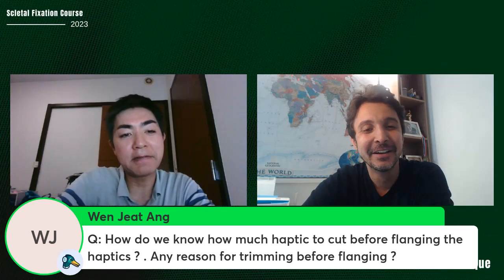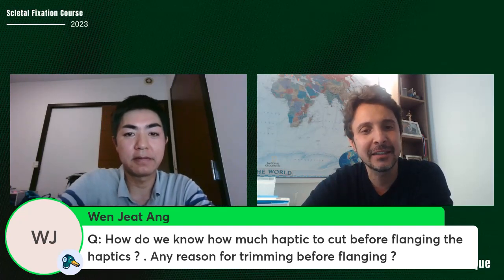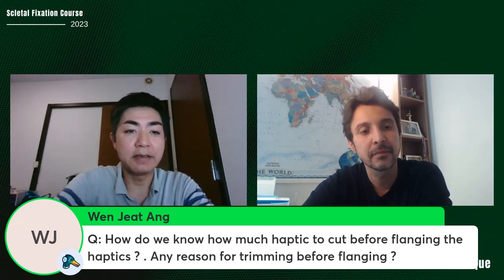Don't you have a Zeiss one, the CT Lucia? No. I think CT Lucia is a good IOL too, right? Yeah, the PVDF haptics are very flexible, so very fit for the Yamane technique.